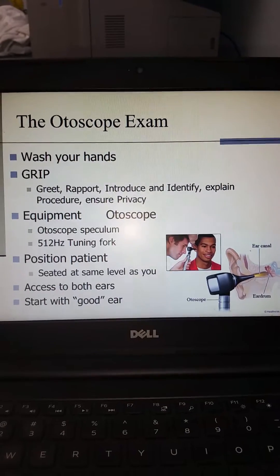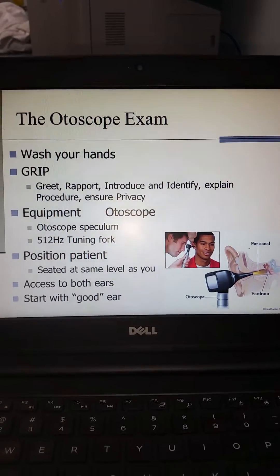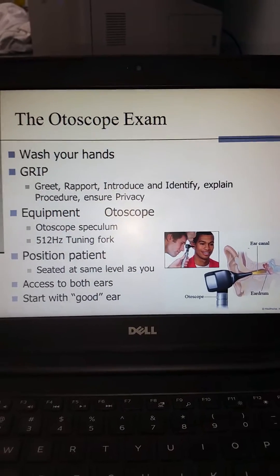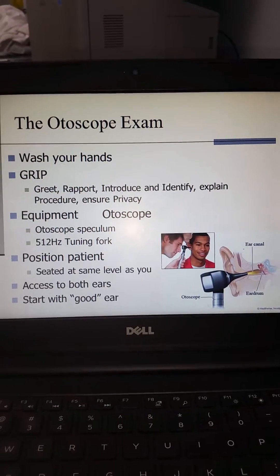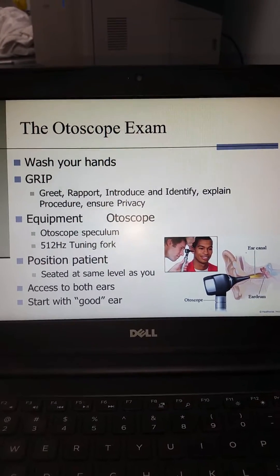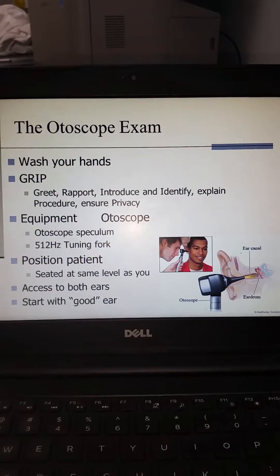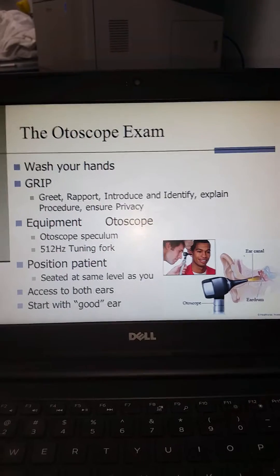The tools we'll be utilizing for the examination are your otoscope with a clean speculum and a 512 hertz tuning fork. You may use other tuning forks but try to keep in this range. Remember that you should position the patient so that they're seated at the same level as you are. Make sure that you're assessing both ears and that you start with the good ear.